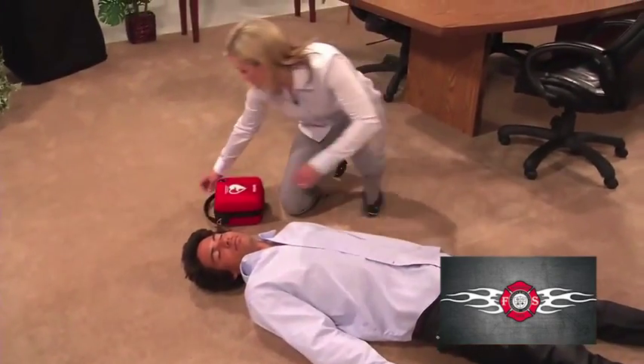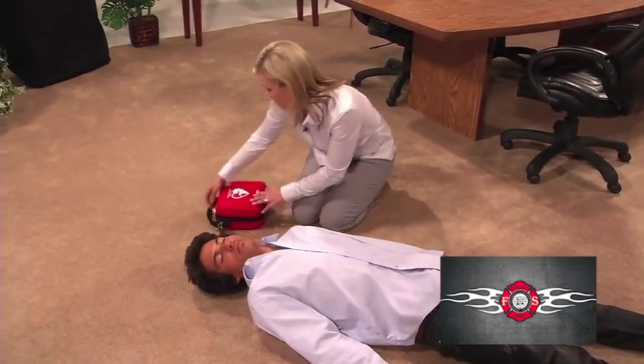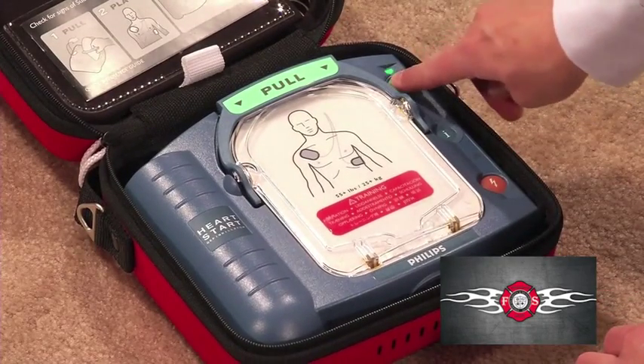In case you need to help someone in cardiac arrest, set the AED on the same side of the patient as you. Press the On button.